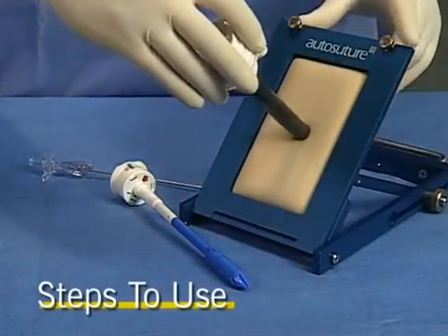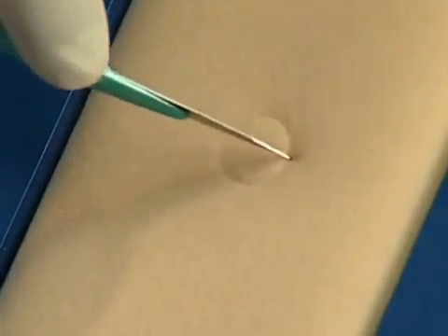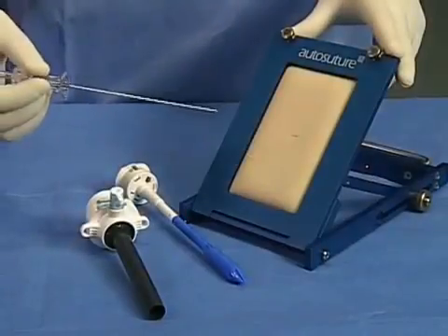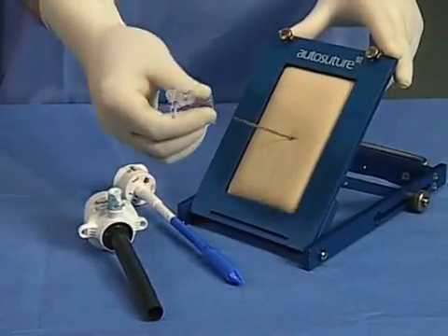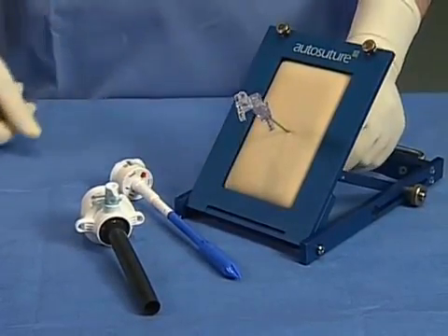Steps to use: Create a skin incision adequate for the diameter of the cannula to be inserted. Establish adequate pneumoperitoneum using the Veress needle or standard insufflation needle.